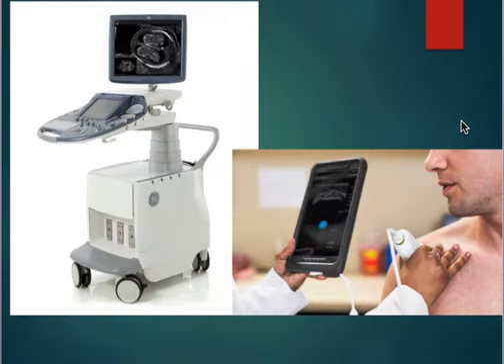The difference is they're not as high resolution. So you're not going to get as good of a quality image out of this. But they are great for quick little scans, emergent situations where you just need to see something real quick. They're even great for military, for taking right out on the battlefield. I mean, somewhere where you're not going to have access to a standard ultrasound machine. But as of right now, these are not going to replace a standard ultrasound machine.